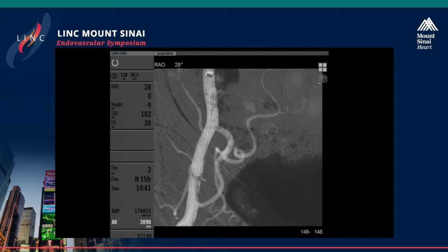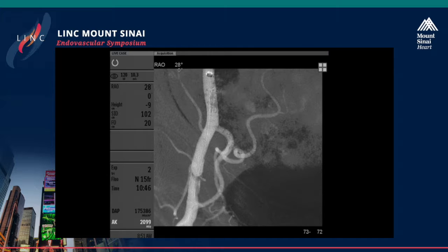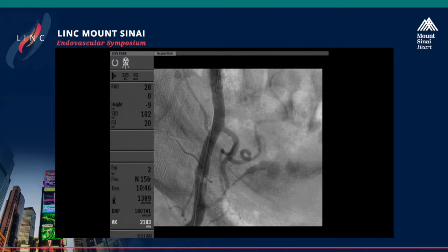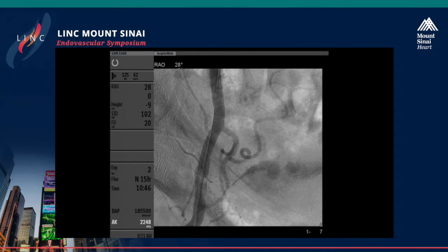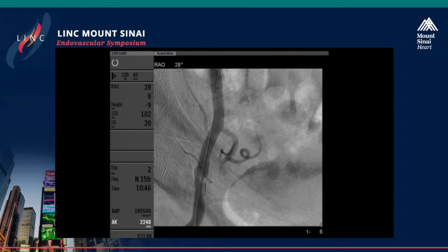So Tom, I know you have tremendous experience. I'm just curious in terms of what you would do here. Well, basically, I would do the same as what you are doing now. Plaque excision would be my first choice, followed by DCB. There's some calcium, but it's not severely calcified. And I believe plaque excision, meaning directional atherectomy, is the right way to treat this.